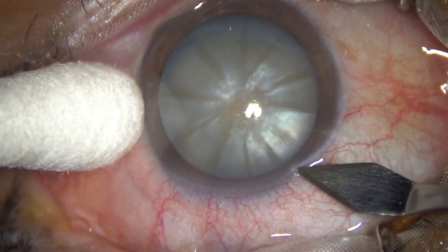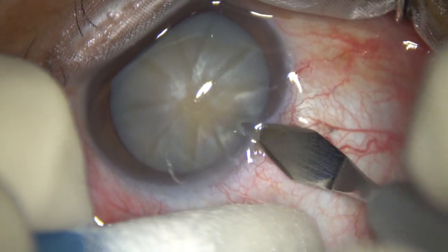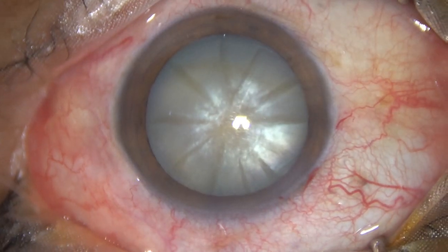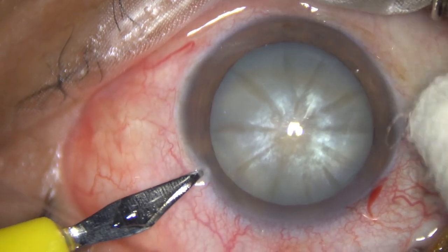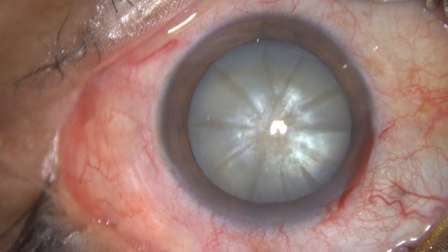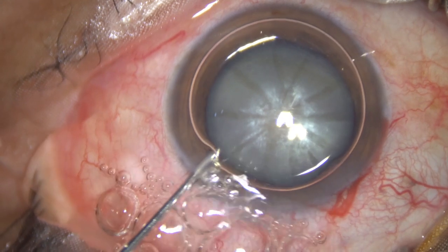This is the main incision with a 2.8 mm steel keratome at around 11 o'clock. And now a side port about 3 o'clock hours away from the main incision on the left side. Only one side port has been made in this case.